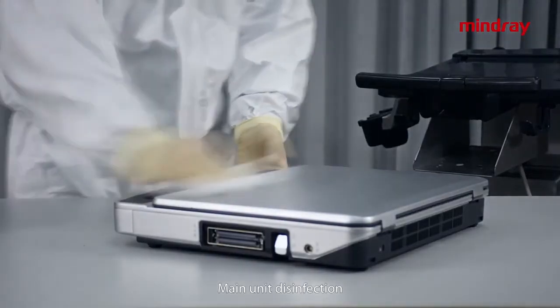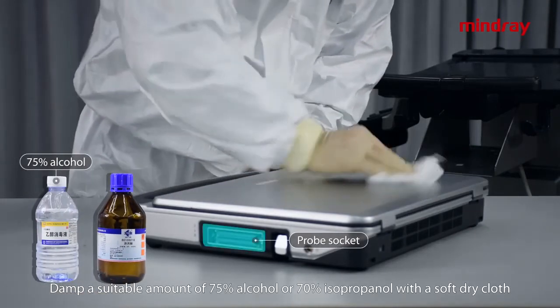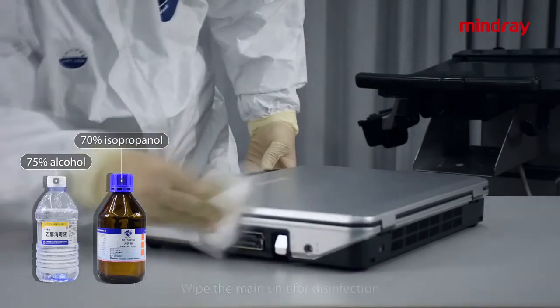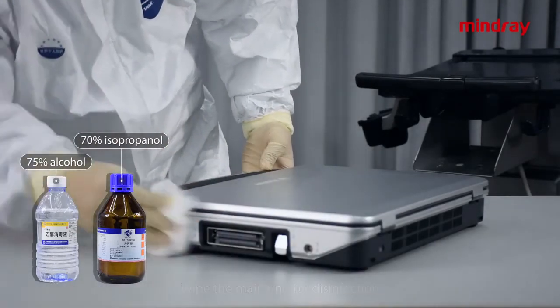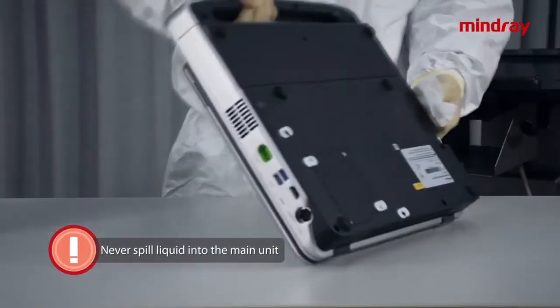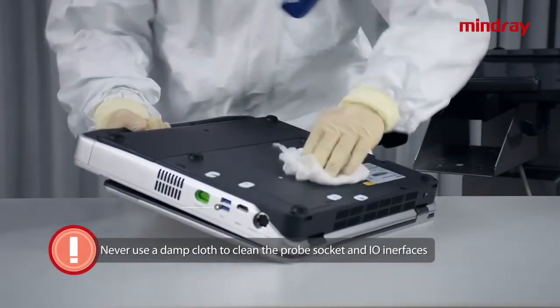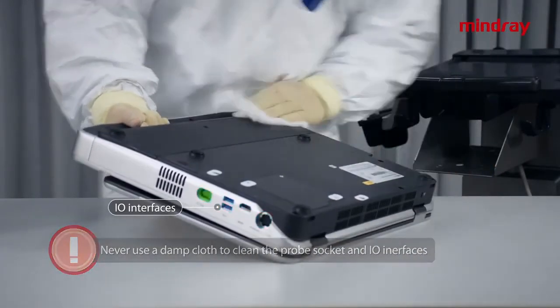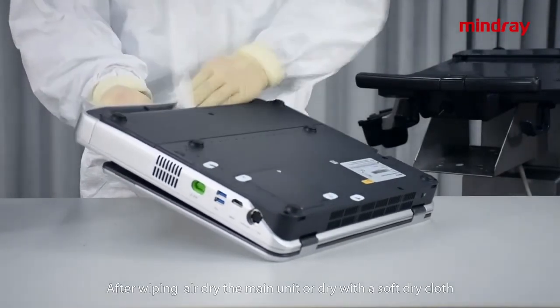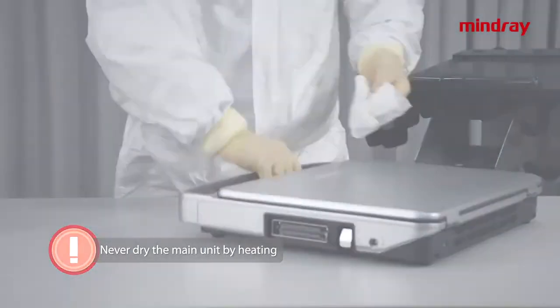Main unit disinfection. Dampen a soft dry cloth with a suitable amount of 75% alcohol or 70% isopropanol. Wipe the main unit for disinfection. Caution: never spill liquid into the main unit. During disinfection, never use wet wipes to wipe the probe socket and I/O interfaces. After wiping, air dry the main unit or dry with a soft dry cloth. Never dry the main unit by heating.